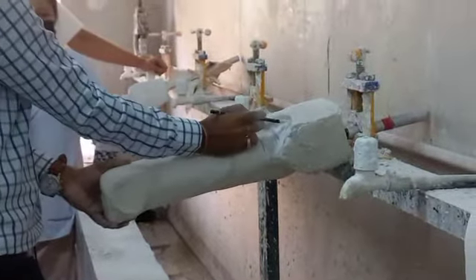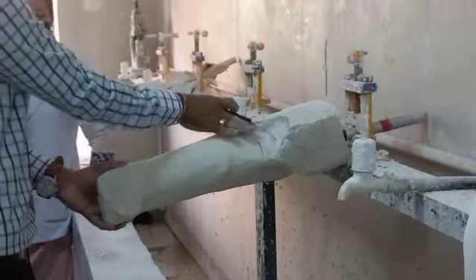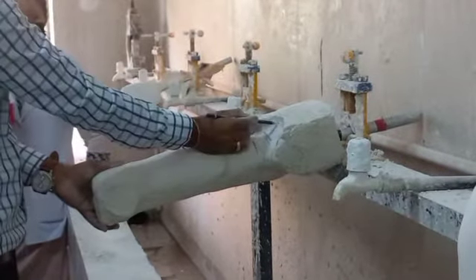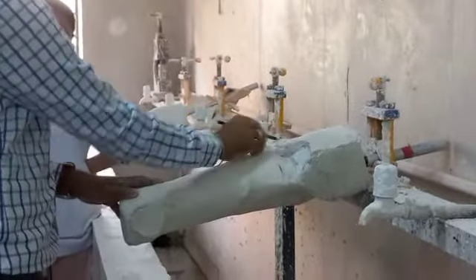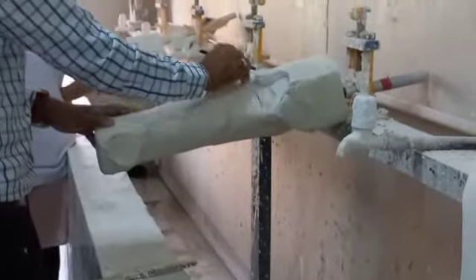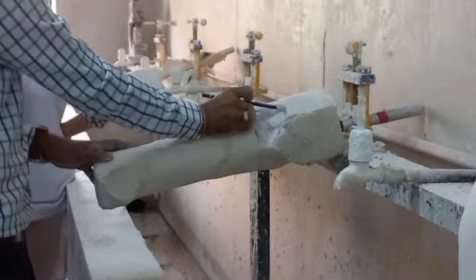On the medial side, what is important is knowing where the lowest point is, and adding some material so that it becomes more down, right? So we have made it down, where we have added half inch material, and then continue with the brim line created during the casting. So you will see that it's almost like a Y shape, isn't it? Kind of a Y.